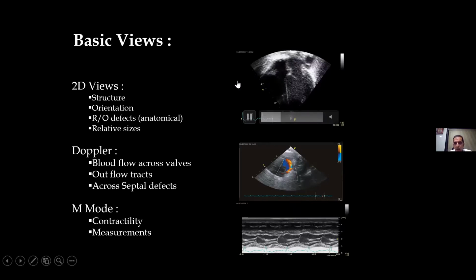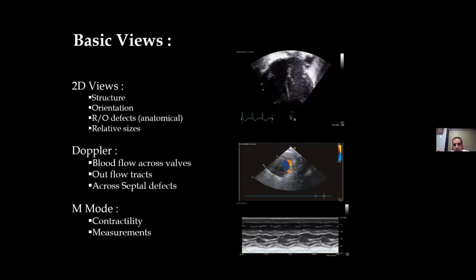Now, suppose there is a preterm baby, 900 grams, 27-28 weeker, and you have started doing the echo on the 3rd day of life. For the first week, in preterm babies, most of the time we tend to see the RA and RV as predominant chambers because of the physiologically high right-sided pressures.